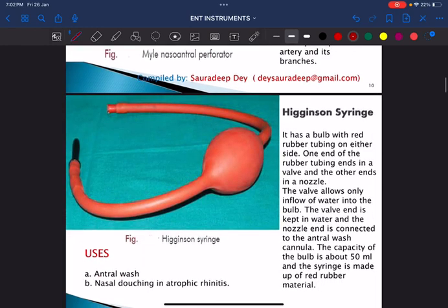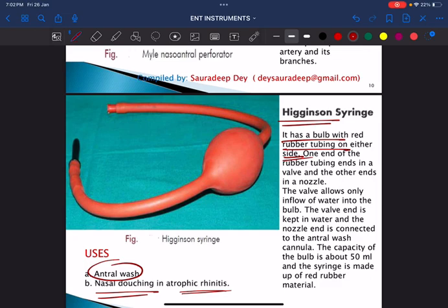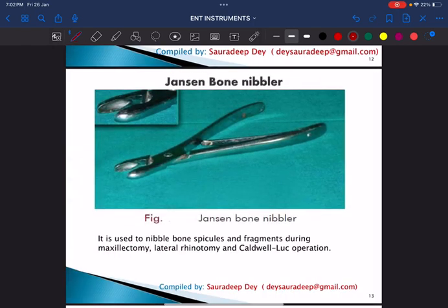This is called the Higginson syringe, a very commonly kept exam instrument. It is a bulb with a red rubber tubing and is used for antral wash or nasal douching in cases of atrophic rhinitis. In atrophic rhinitis there is excessive crusting, so the Higginson syringe is used to perform nasal douching.